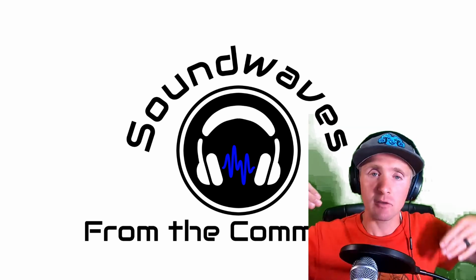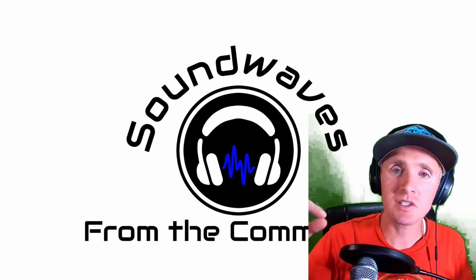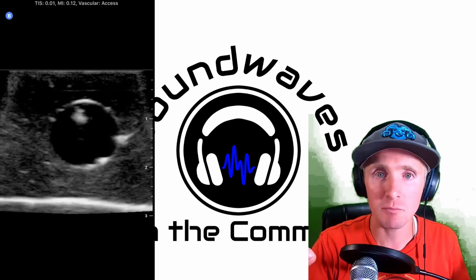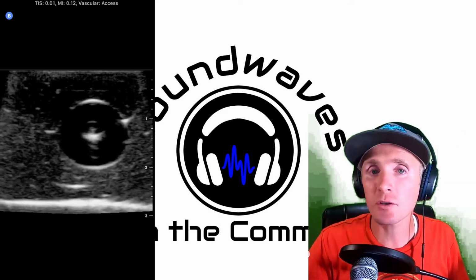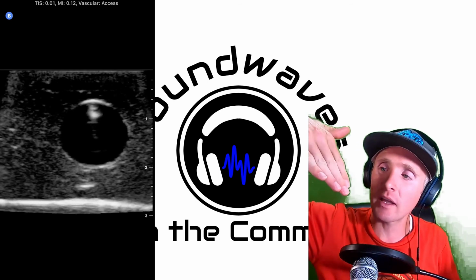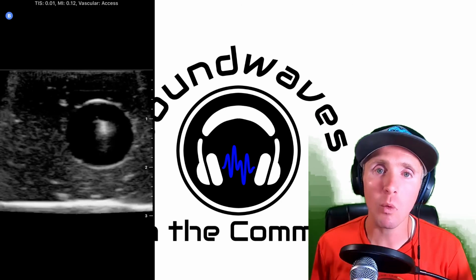Drop and advance. So if you're coming in at a 45-degree angle and you've penetrated that vessel wall, you should see that bright white dot somewhere inside the lumen of the vessel, in that anechoic circular space. What I like to do is leapfrog it just a couple more millimeters until that tip is close to the posterior wall, and then I'll drop my angle and flatten it down. What that does is it lifts the needle tip up towards the anterior wall of the vessel.